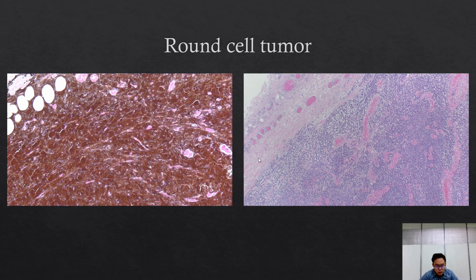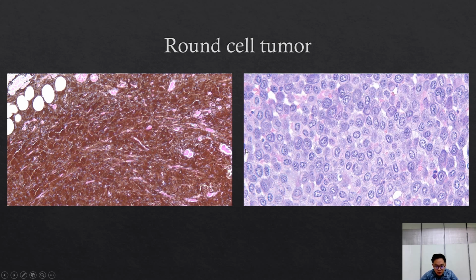And then when we look under higher power field, you can see different features in these cells than the melanocytes. When we look at these cells, you can see that they have cytoplasm full of these little blue granules, and that indicates to us that this is definitely a mast cell tumor. So those are kind of the things we are looking at, just to give you an idea of the different structures the tumor makes and how the cells look different from other cells to get a diagnosis of what types of tumor these are.